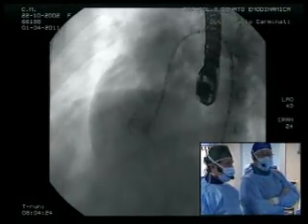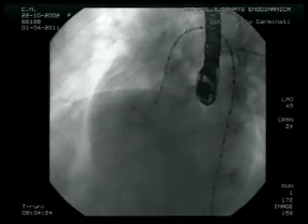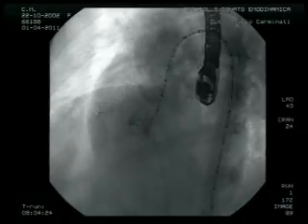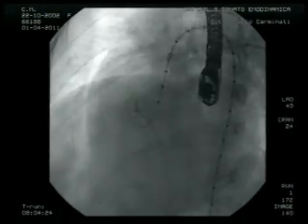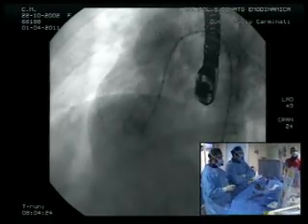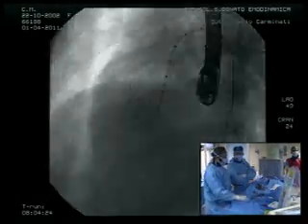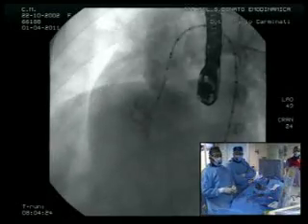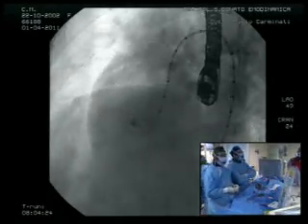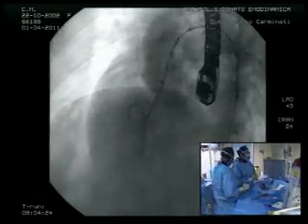It's just about to come up. Whilst you're finding the angiograms of fluoro, Mario, just a quick natural history question. With that size VSD, in an 8.5-year-old, what was the reason for delaying the closure of the VSD? Because we saw this patient for the first time 1 year ago. She was followed in other institutions.